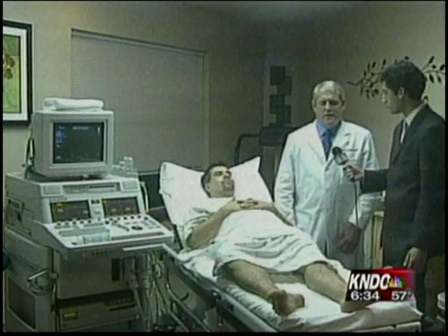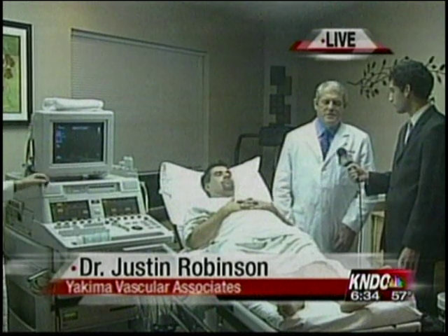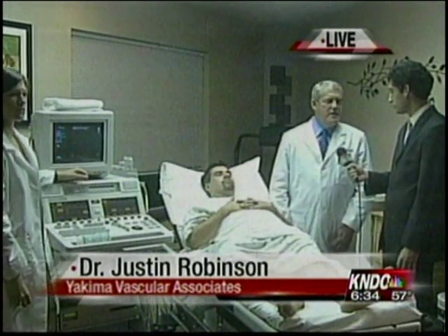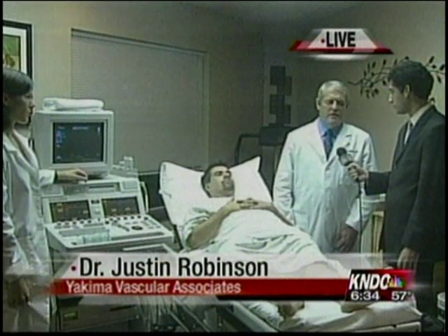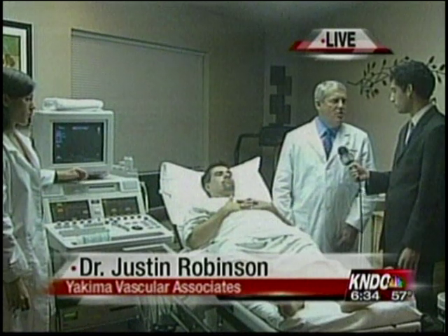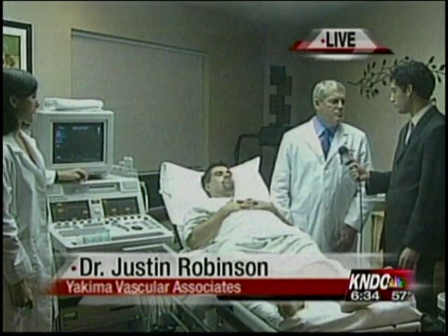What's that? Right. The next step after we've decided that the patient has vascular disease is to find out in general where it's located in the leg and how severe it is. And for that we do a duplex scan of the leg. And that's an ultrasound test where we can actually see the arteries using sound waves and then measure the speed of the blood as it goes through the artery.